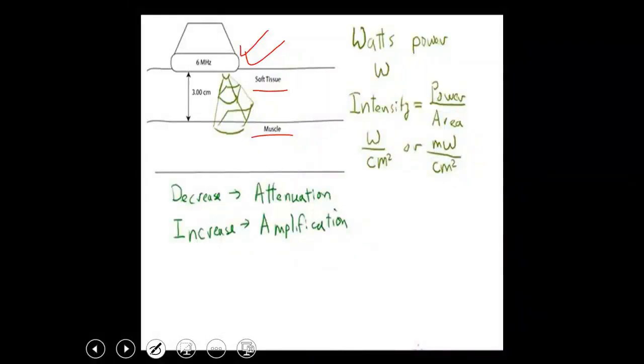For a certain value, remember there was someone who invented the telephone named Graham Bell. You must have heard of him. Graham Bell is the one I refer to as Bell. We are talking about ultrasound and its uses, and this unit expresses the amount of attenuation that occurs in the ultrasound beam during its path, while the ultrasound beam passes through.